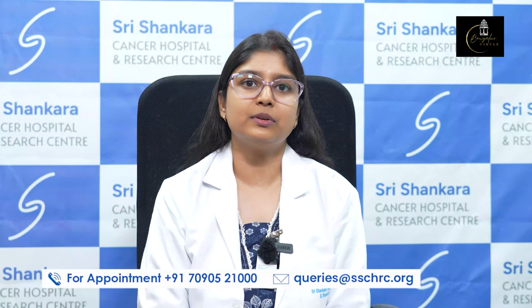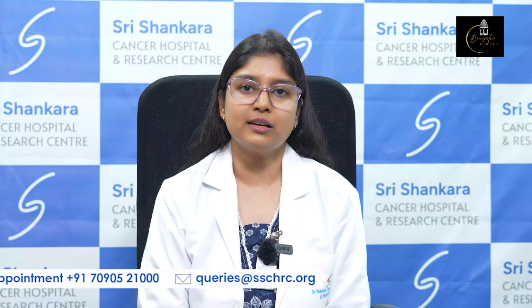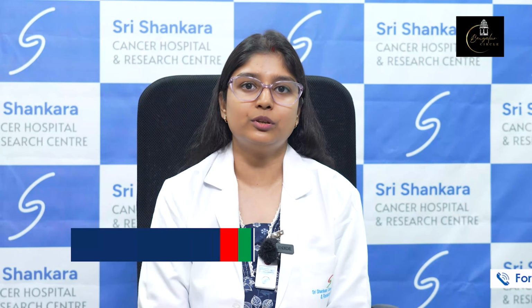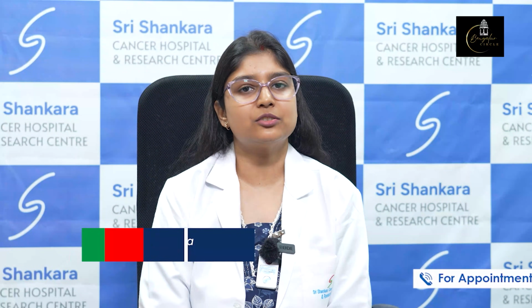The first thing we do is check the blood sugar levels and the vitals, to see if the patient is stable and whether the blood sugar levels are within control. If it is within control, that is within 200 mg per deciliter, then we can take the patient for the scan. If it is more than 200, then the patient might be rescheduled and told to control blood sugar levels and then take an appointment. So once the blood sugar level is in control and the patient is stable, we take the patient for the scan.